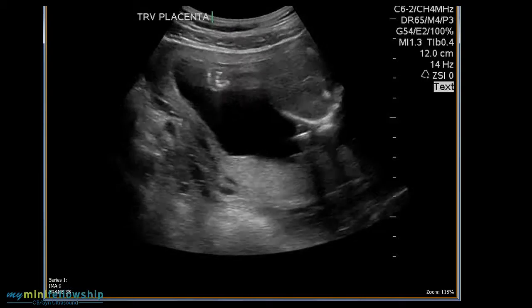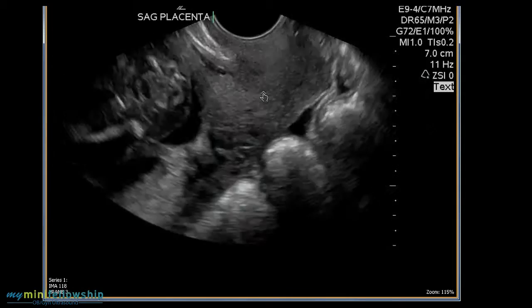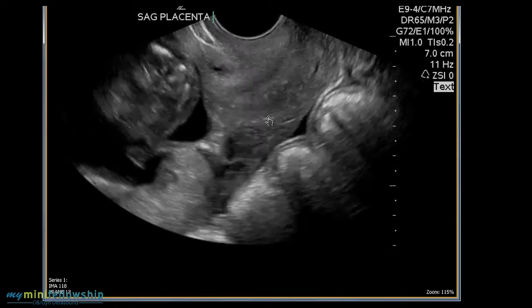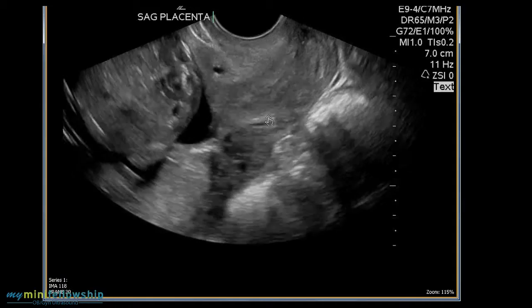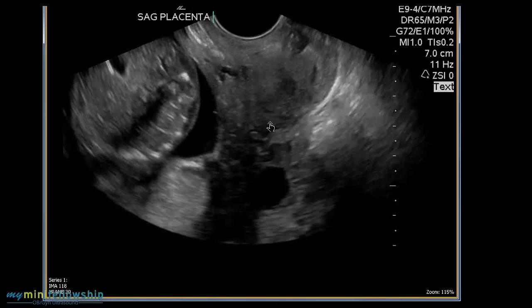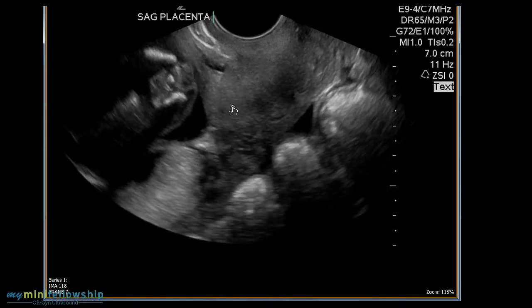And then also, you want to comment on the location of the placenta itself with relation to the cervix. So, the important thing to remember is that the names that have been given to placenta previa, marginal, partial, complete, central, those were all developed before the advent of ultrasound, and in my opinion aren't very helpful. What I'm interested in is whether the placenta itself actually has an attachment onto any cervical tissue. If that is the case, I will call it a marginal previa. It doesn't have to come to the edge of the internal os.